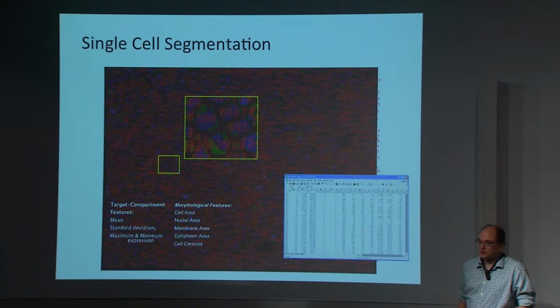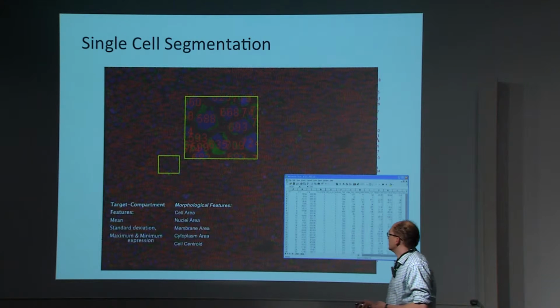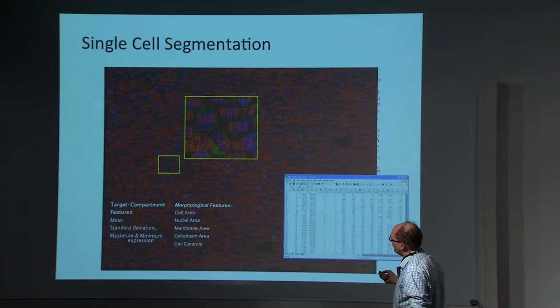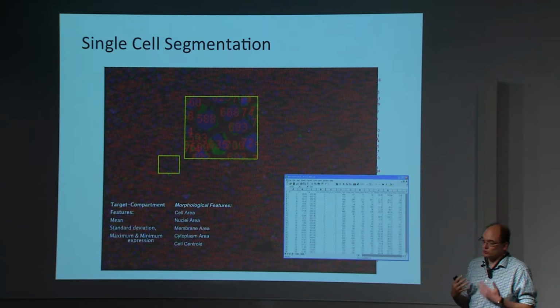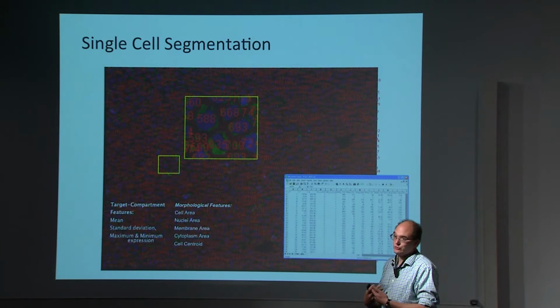So what you get is a high content signature for tissues. Essentially, every cell has a number, every cell has parts: nuclei, cytoplasm, and membrane, and then you can have up to 200-300 measurements per cell. Okay, and now you're trying to use this technology in meaningful studies.